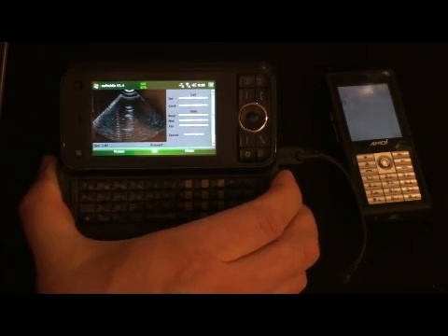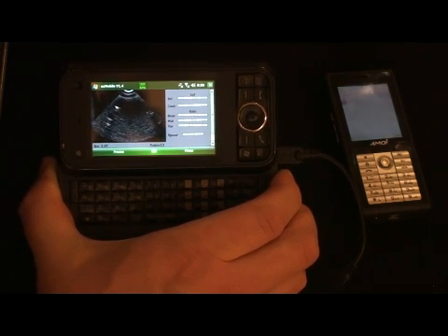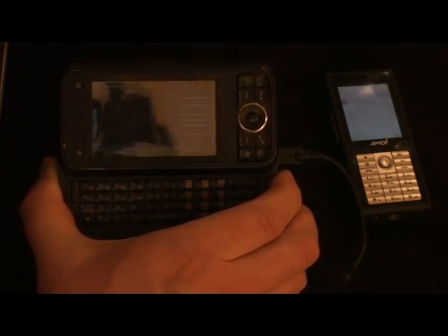But this is all — all the scanning here is taking place with just a simple probe connected directly to the phone.